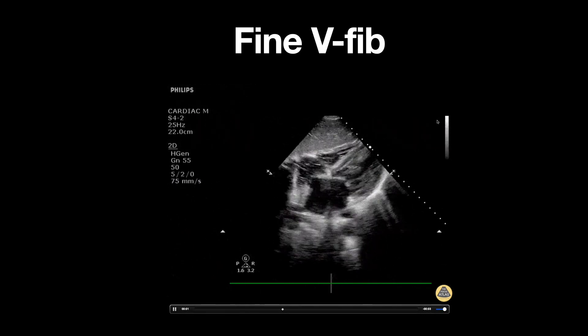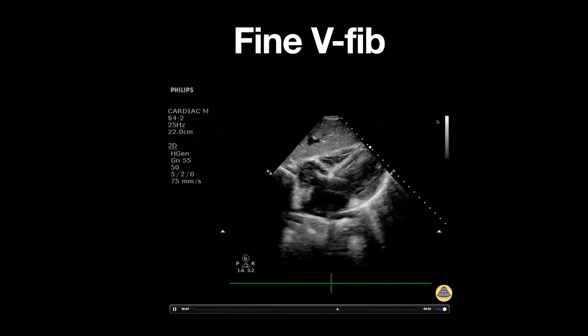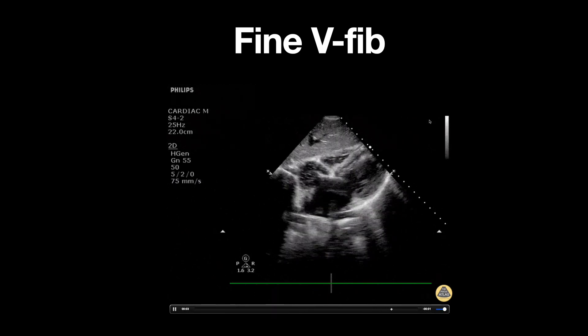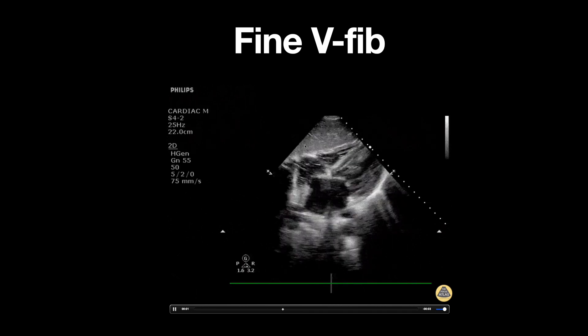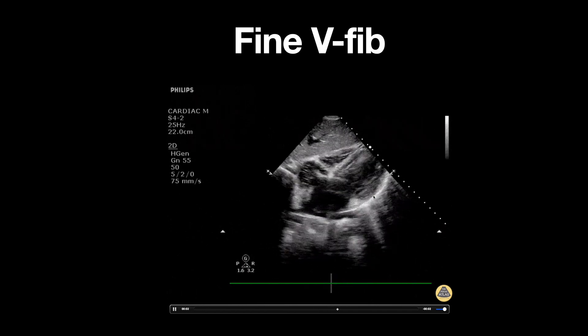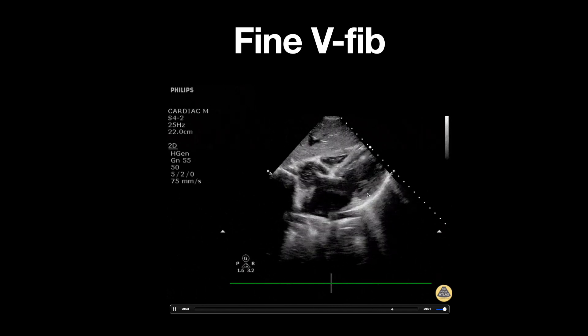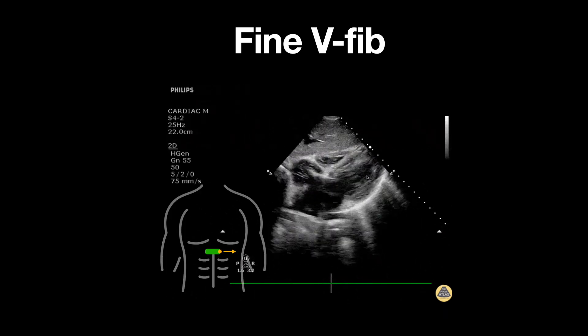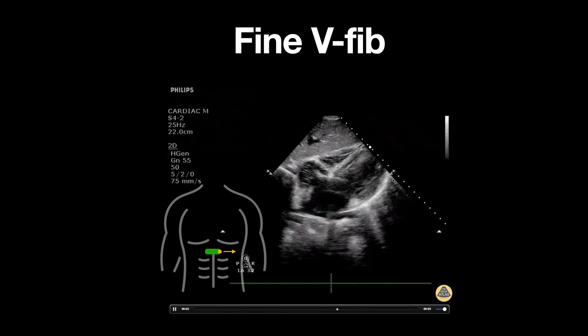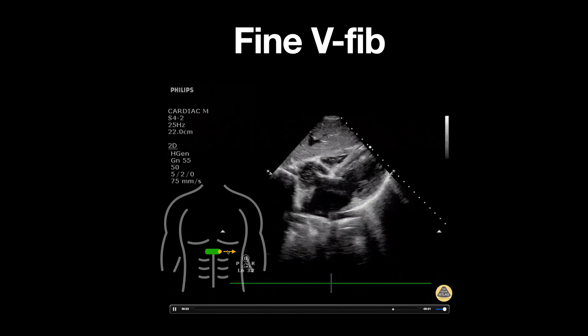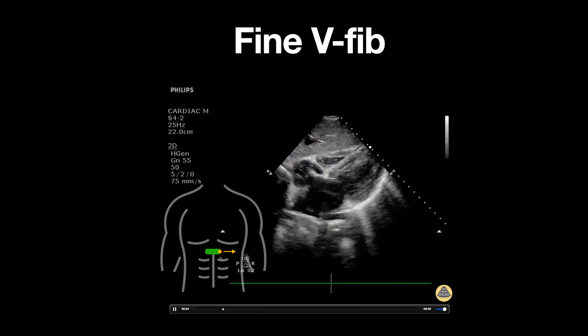For this clip we're using a phased array probe, as delineated by the shape of the footprint at the top of the screen. The probe is placed in the subcostal space with the probe marker pointed towards the patient's left side.